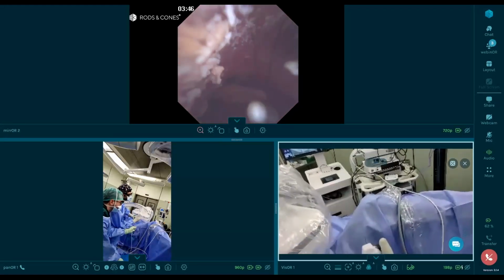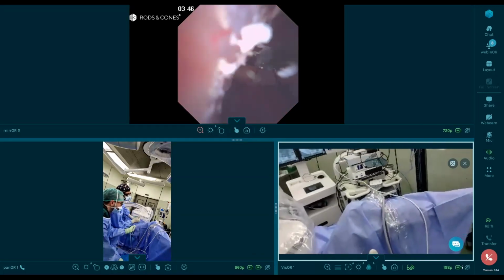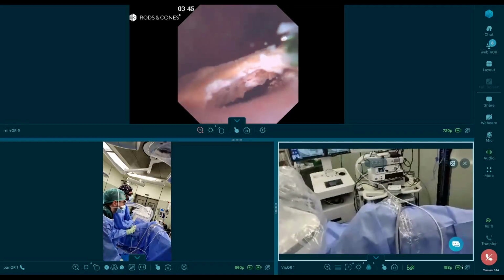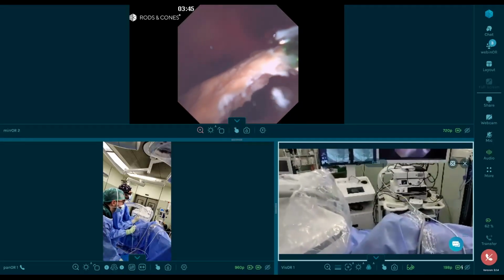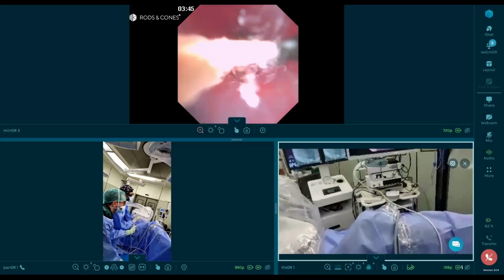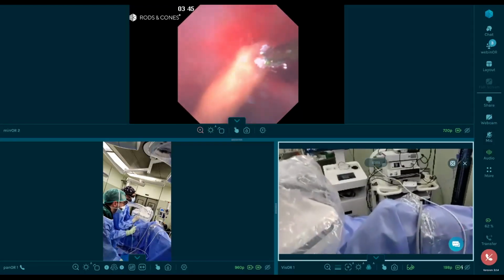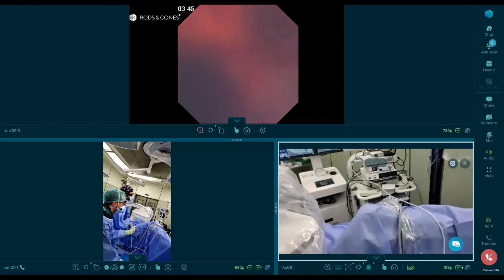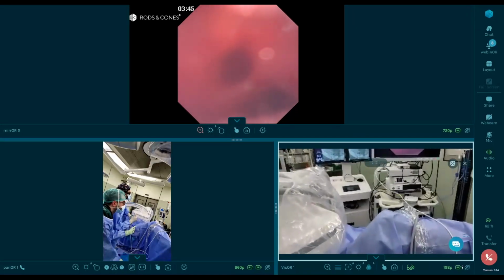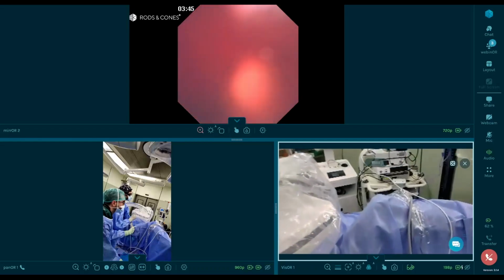Abre el tamaño de la cesta. Baja. Cierra. I always tell my resident to open the size of the stone. Cierra. The size of the stone. This is important. And then you give yourself some space. You see everything that you're doing. You don't put it too close to you. And then exactly what I do is that I push it to a more comfortable position.